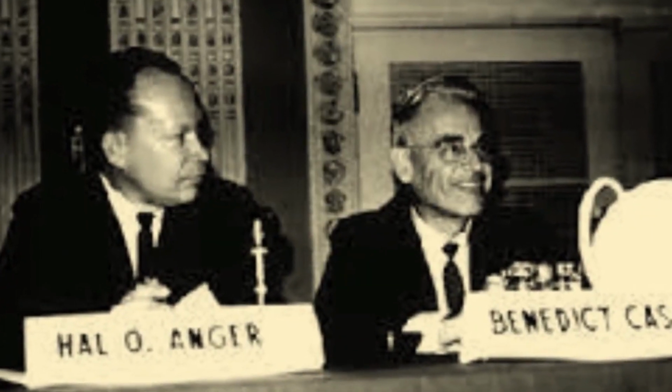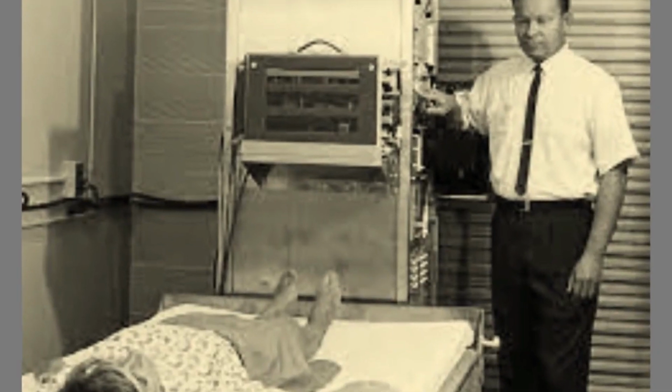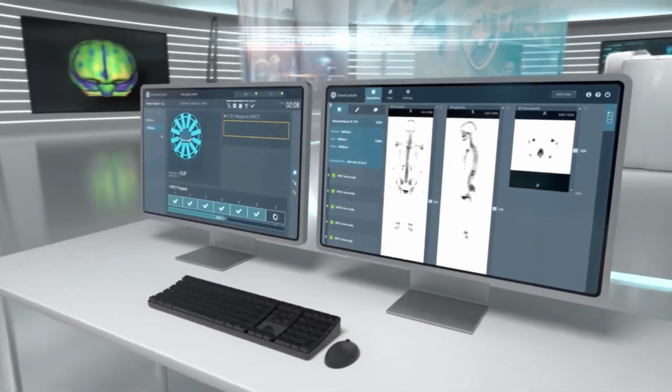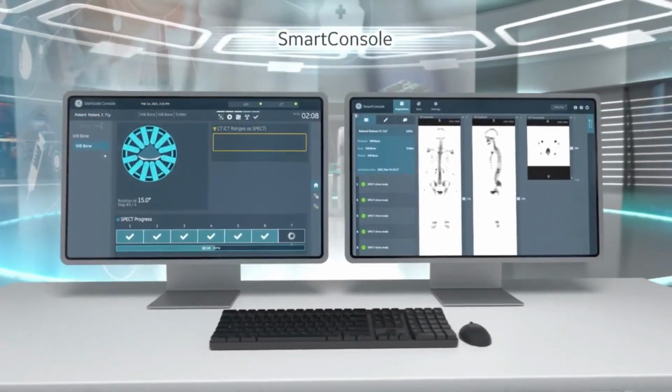About 10 years later, they became widely used, and soon they pushed the scanner out of visual diagnostics. From 1965 to 1974, various centers developed their own computer programs. After 1974, computers with incorporated nuclear medicine software packages became commercially available.